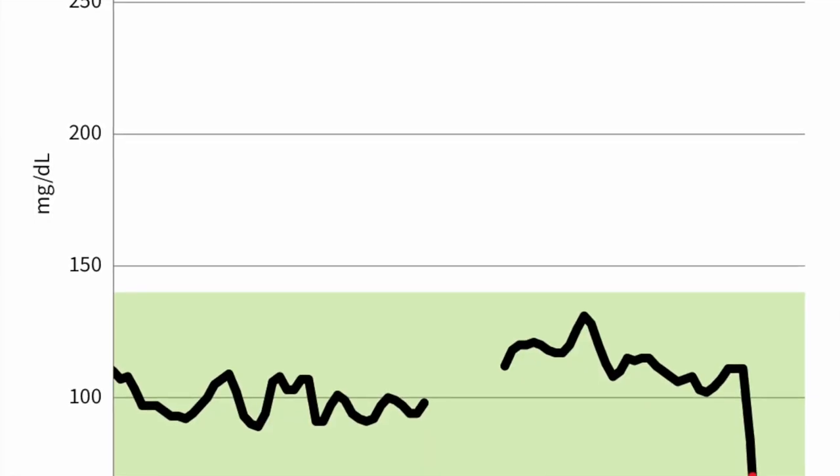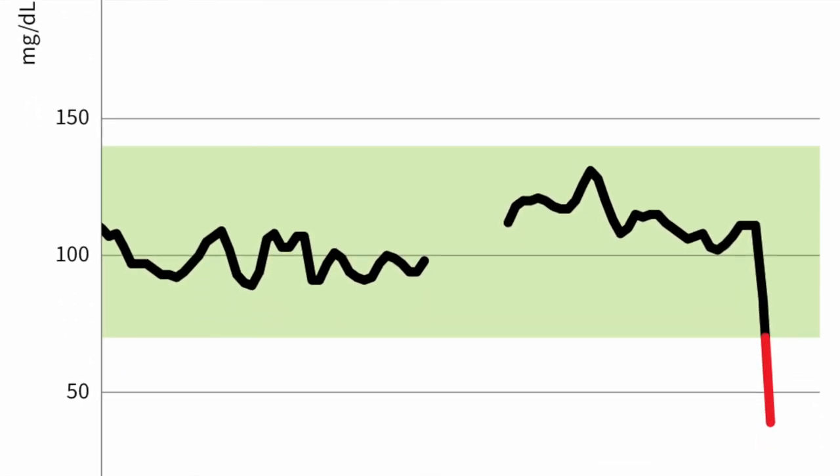Hello everyone — it is day 14 and the end of our Freestyle Libre sensor lifespan. I ran into a doorway and ripped out my sensor, so I'll attach a scan of what the sensor reading looks like — it looks like I literally dropped off a cliff. Typically what I do when I swap out sensors is I switch arms, so we'll put the new one in on my left arm and continue the cycle. This is a great product. If you're not already using a continuous glucose monitor of some kind, I highly recommend Abbott Laboratories Freestyle Libre — it works with your phone and can be a great addition to your diabetes management.